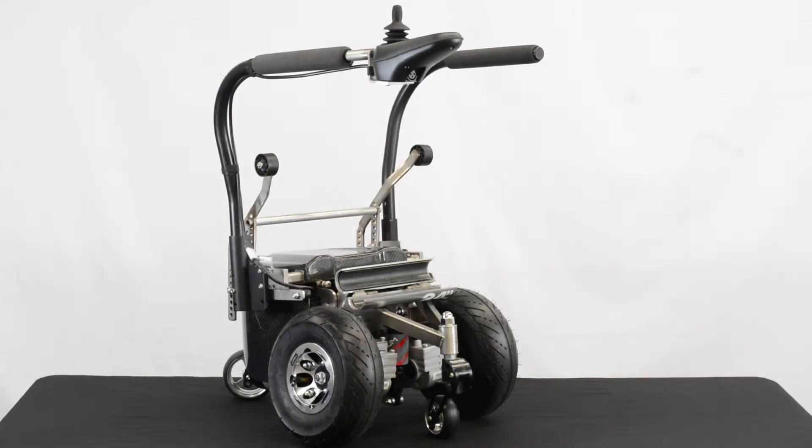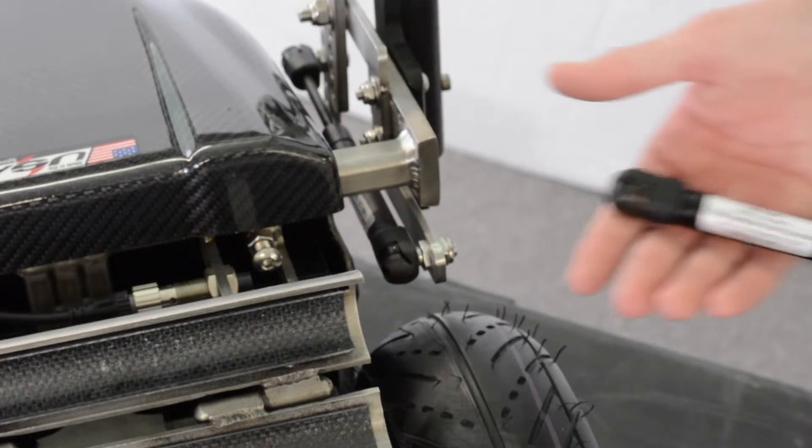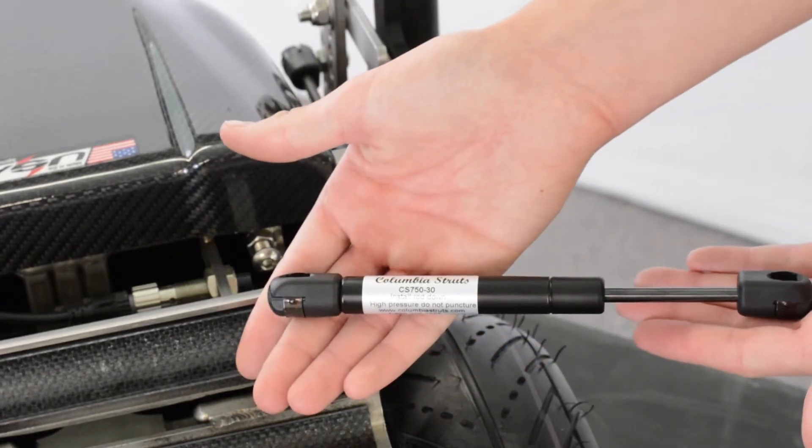The ZX-1 can accommodate users that weigh up to 250 pounds by simply adjusting the anti-tilt springs. The ZX-1 anti-tilt device has three different springs that coordinate with the user's weight to optimize the resistance that the device gives you.